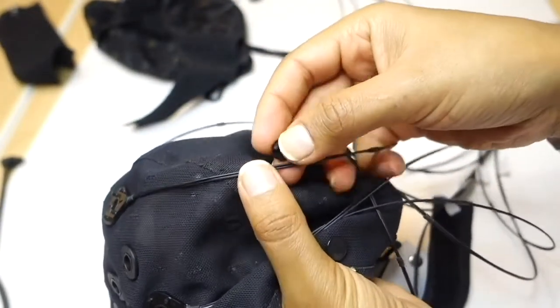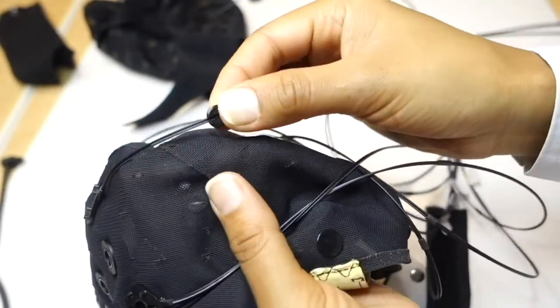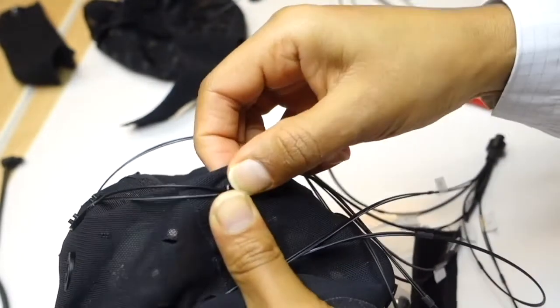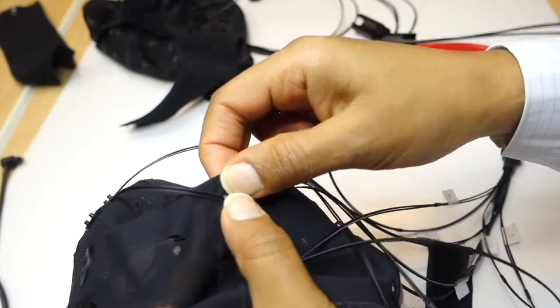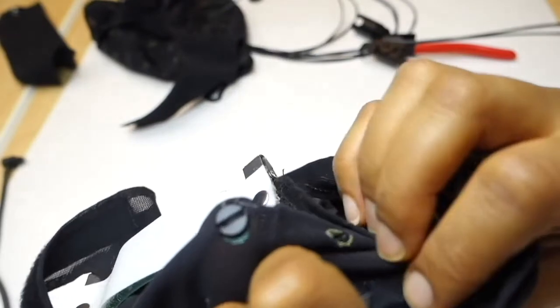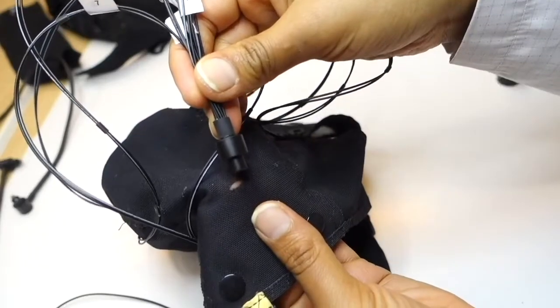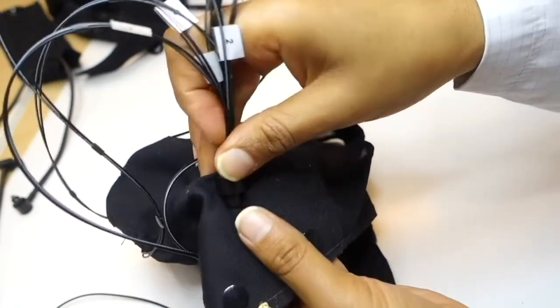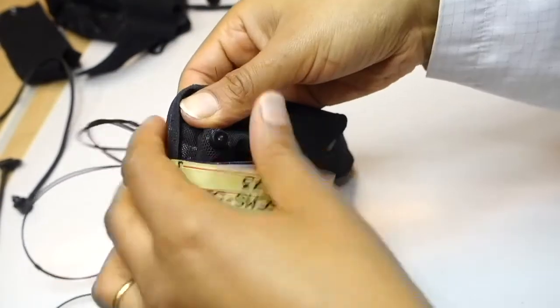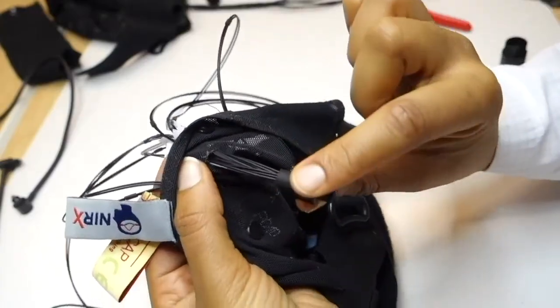So just place the clip with its slit on top of a fiber, just slide the wider portion of the clip into an available slit. You can cut additional slits in the cap if the number or positions are inappropriate for your setup. You could see the fibers are now held in position. If you still have an unoccupied position available, you could bring the short bundle outside the cap through an available slit as shown here. It helps in organizing a bit.